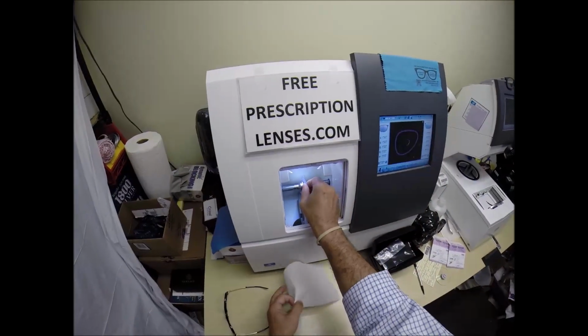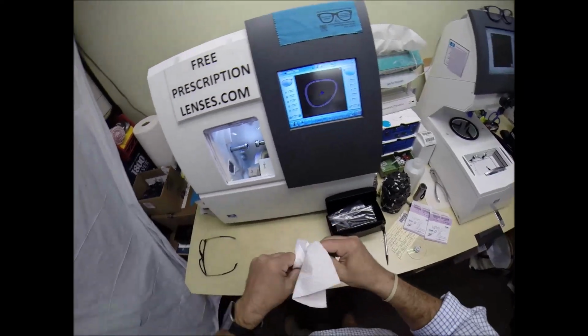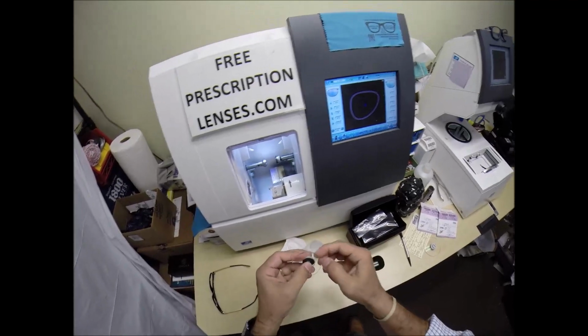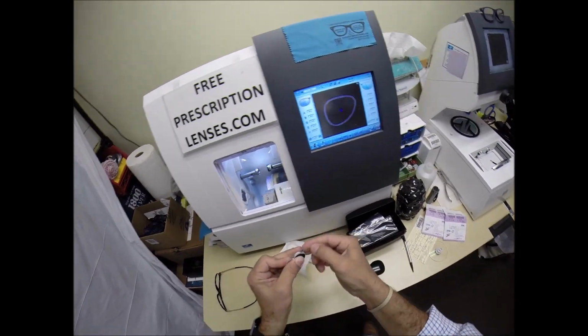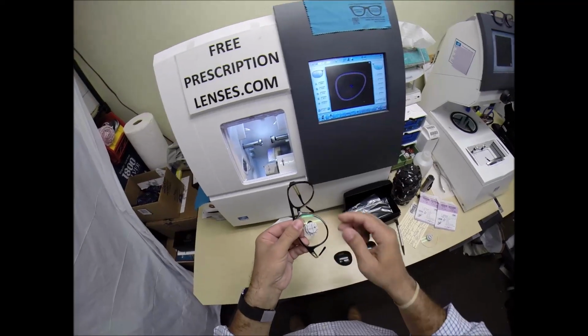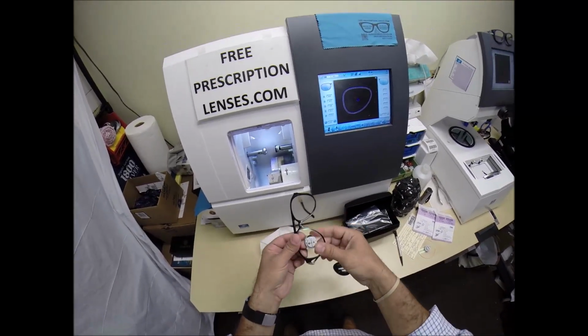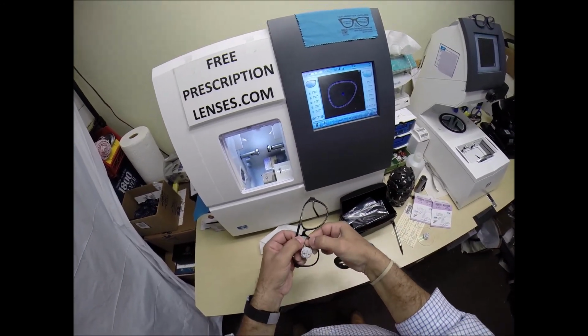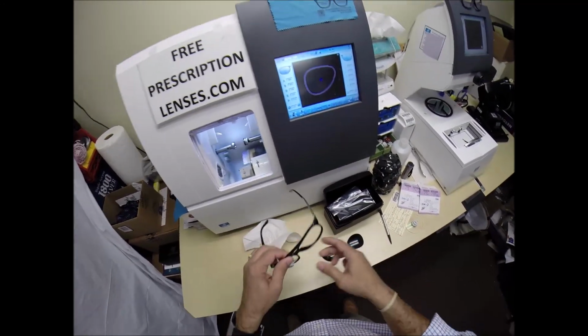So let's go ahead and put the clear lenses in there. And make sure there's no optical sawdust. There we go. Again, just like before, I have the side I'm working on closest to me. I'm not trying to reach across the frame or do anything like that. Tuck it in at the outside corner, and with my thumbs push down at the nose, it snaps right in.